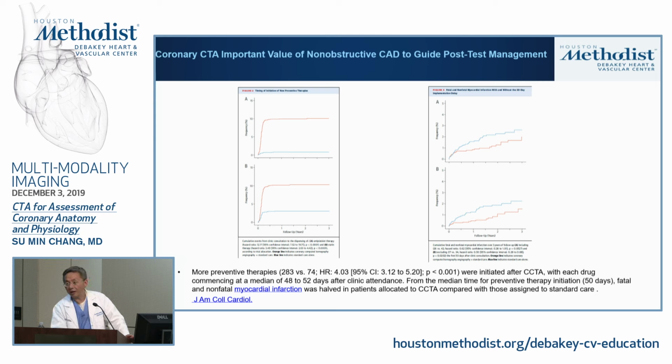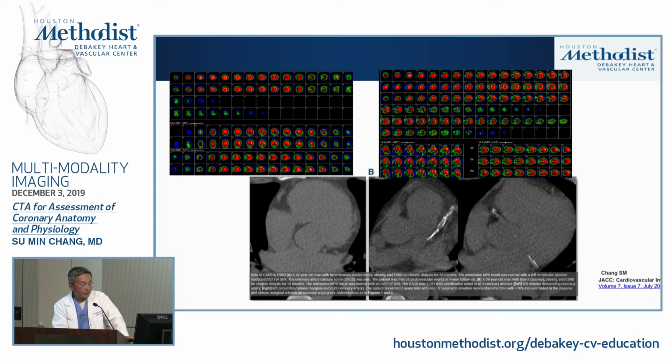All this is kind of common sense. But I think it's nice to prove the point. Going back to these 2 cases here, nowadays, for any functional test you do, regardless of the debate of anatomy versus physiology, you need to know your atherosclerosis burden.